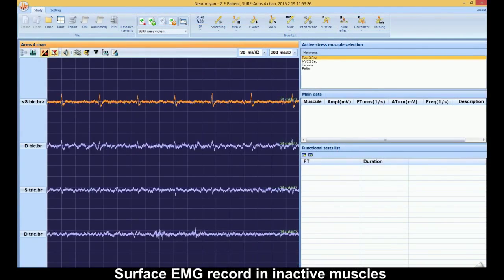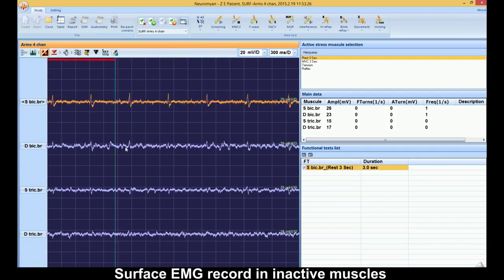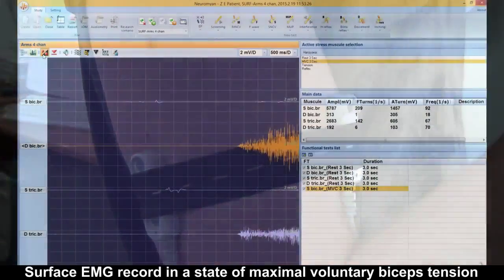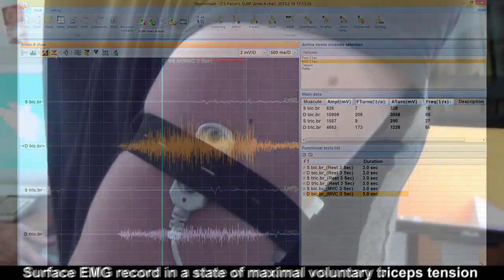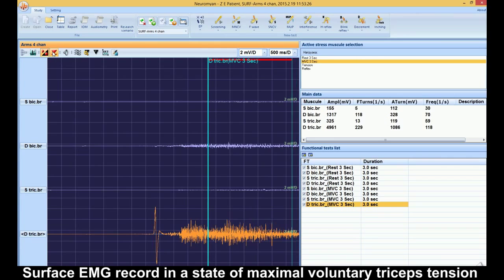Surface EMG recording in inactive muscles. Surface EMG recording in a state of maximal voluntary biceps contraction. Surface EMG recording in a state of maximal voluntary triceps contraction.